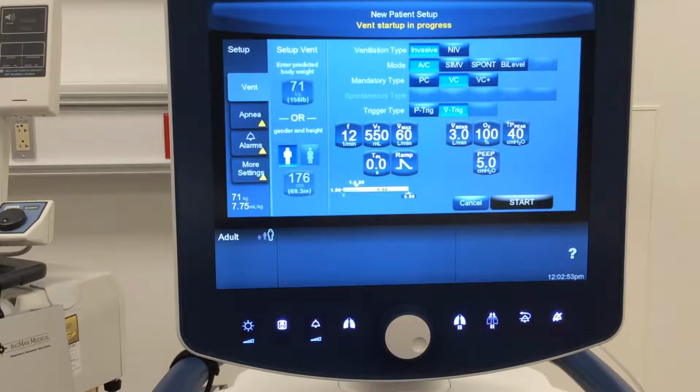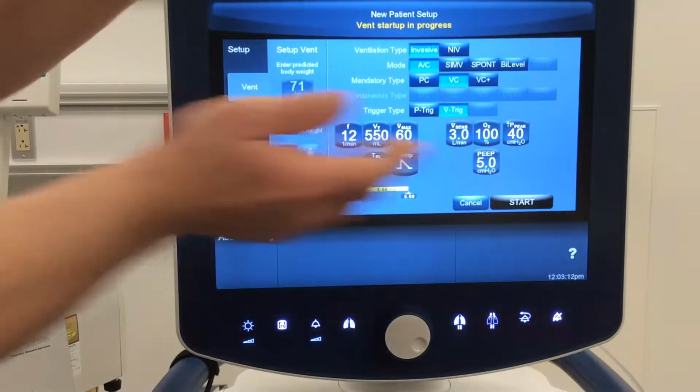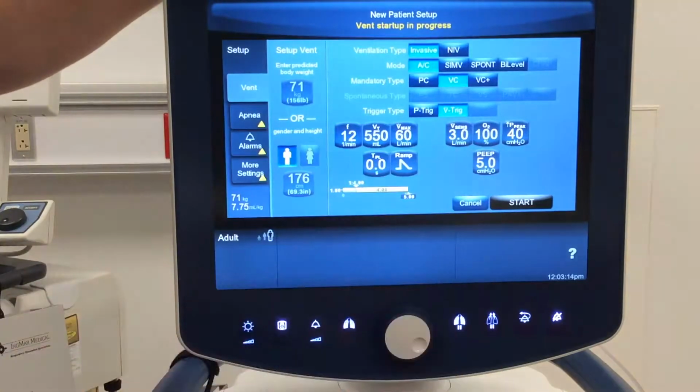As we start getting up to 10, 12, 22, crazy high levels of PEEP, I call that therapeutic PEEP, all right? Or the ability of manipulating that baseline to really drive oxygenation. So we're using it to try and improve something or stabilize the air sac, something along those lines. But most of our patients, especially here in St. Louis, are going to get a PEEP of 5.